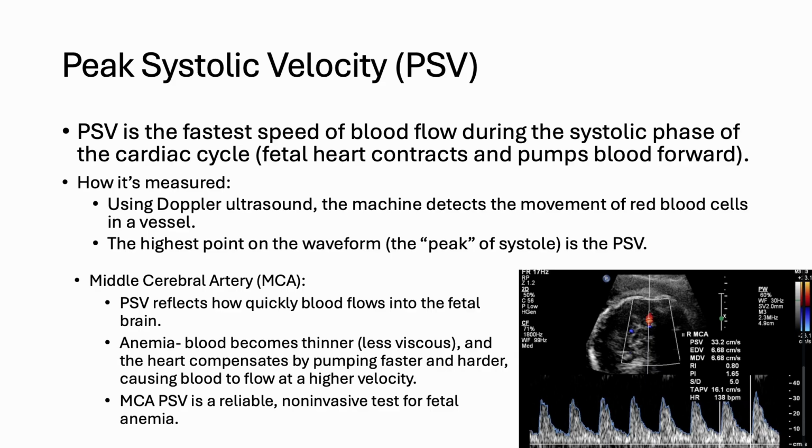So the only way they could determine it in that case is either watching for hydrops, which at that point is too late because the fetal anemia has caused complications, or by actually drawing blood from the baby's umbilical cord, which is much higher risk. So this is a good test, and we're very thankful for it. It is not perfect, but it is a very good test because it can identify fetal anemia much earlier than looking for signs of hydrops.